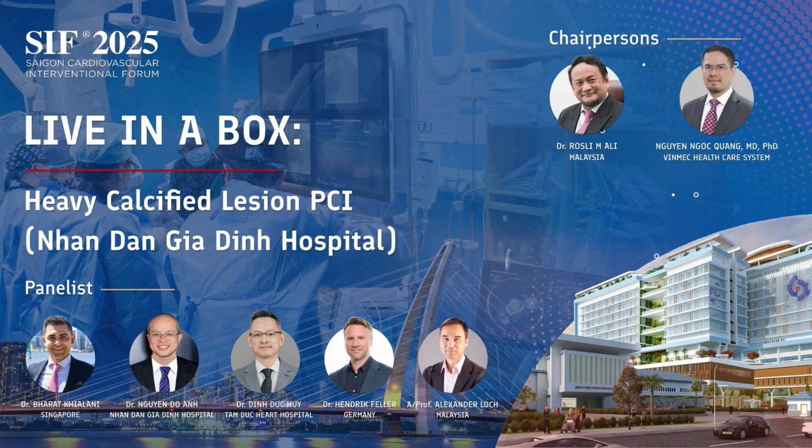Yeah, thank you. So, Professor Alex. Okay, so the two questions, I'll try to be fast because it's going to be a bit redundant here. Imaging, whatever you are familiar with, I would prefer IVUS. It's probably going to be a long procedure. If you go OCT, you have to clear the contrast all the time, with multiple injections. I would not prefer that here. I would do IVUS, number one.